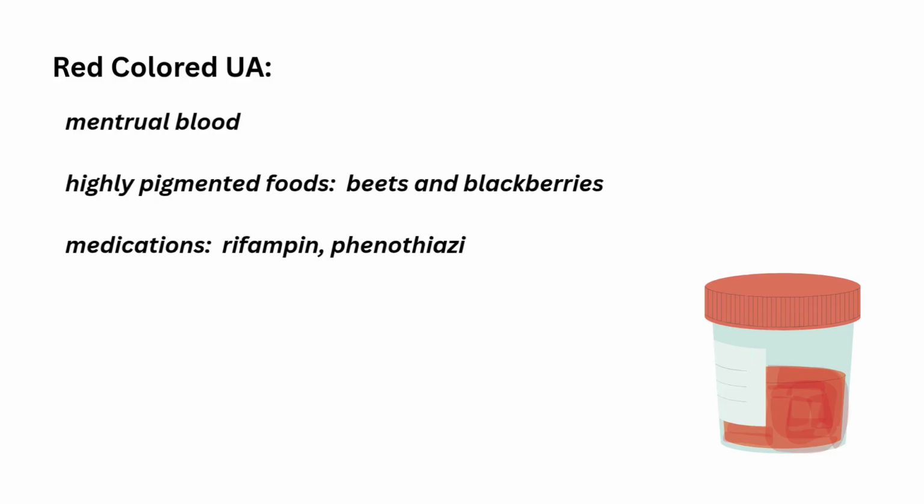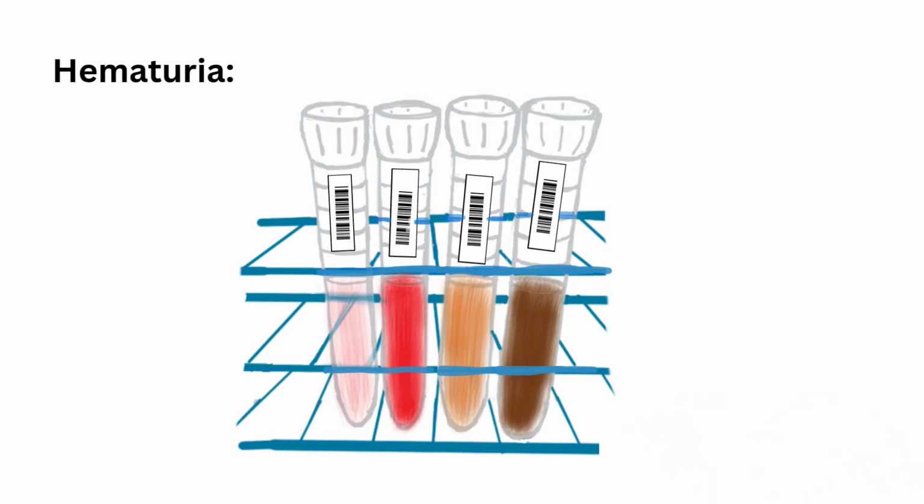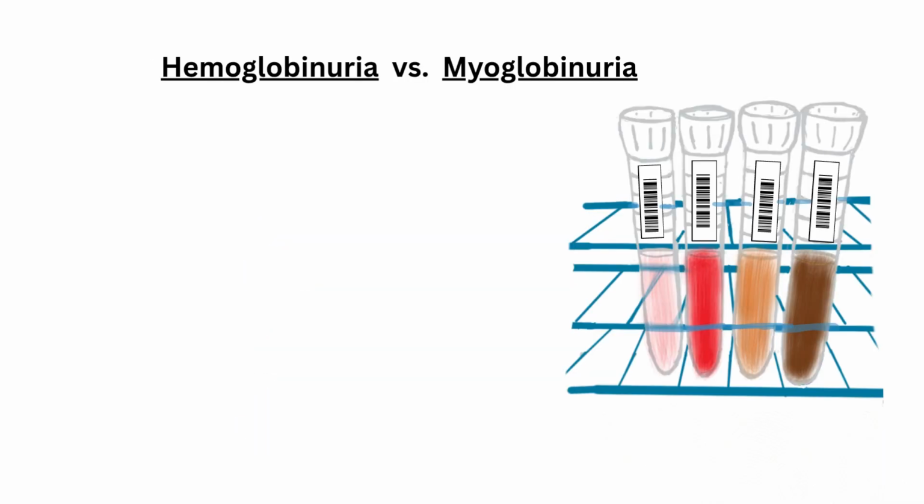There are many conditions which can lead to a red color urine. Hematuria presents in different ways: clear, hazy, cloudy, bloody, sometimes with bloody clots. The color varies from pink, bright red, dark red, or brownish red. Myoglobinuria may arise from muscle disease or injury. Myoglobinuria and hemoglobinuria appear alike in many ways.